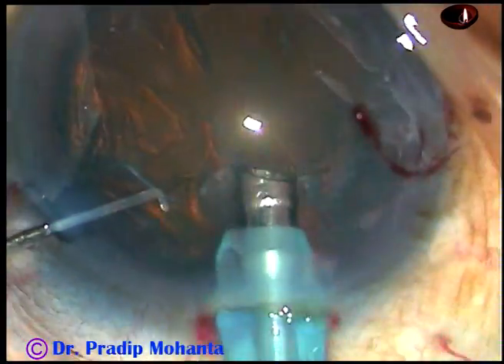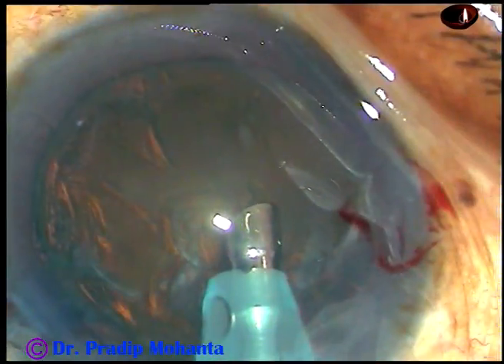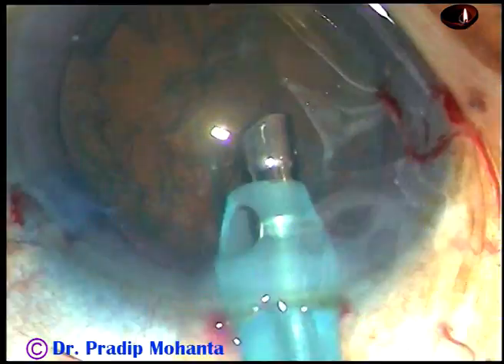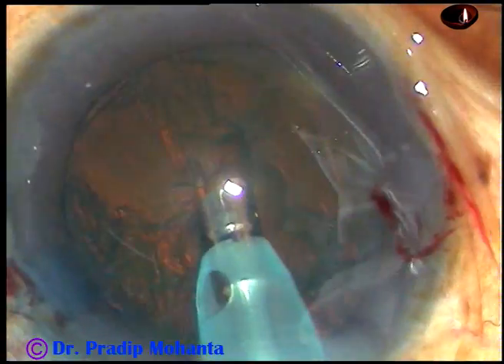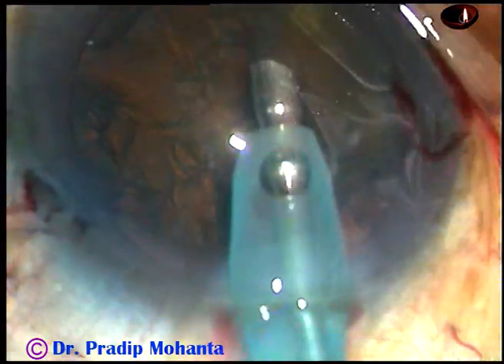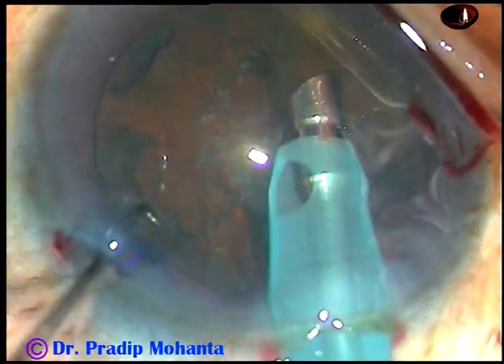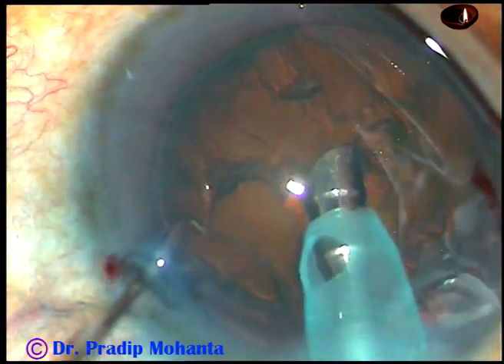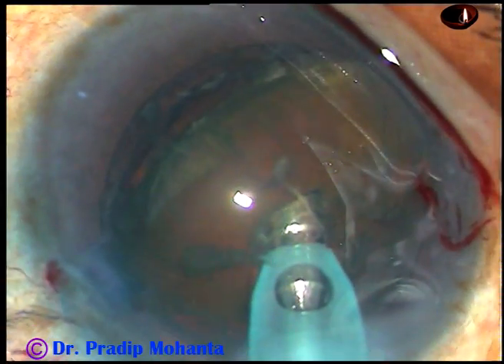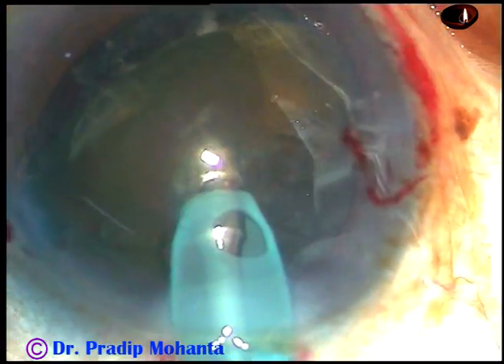Go into the anterior chamber. Apply little vacuum. And then hold the nucleus just little off-center, little on the left side of the center, and tilt it. And now, introduce the chopper.